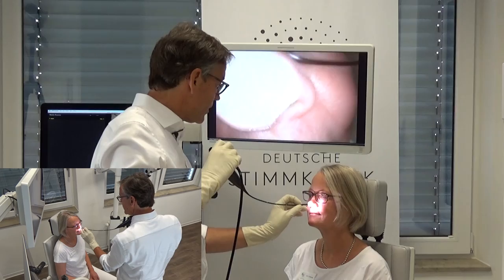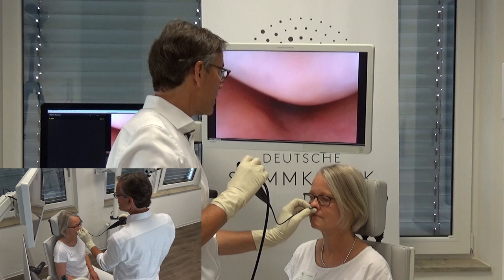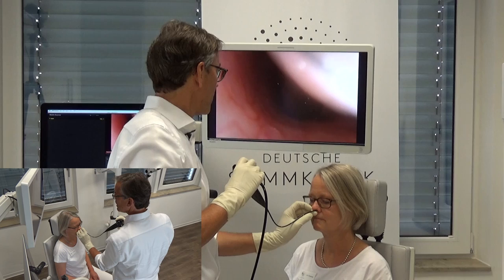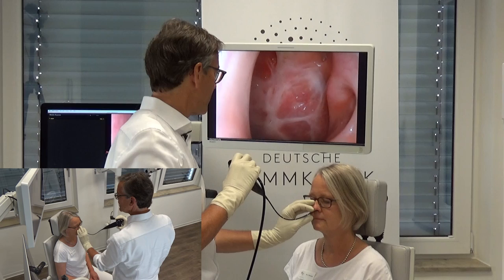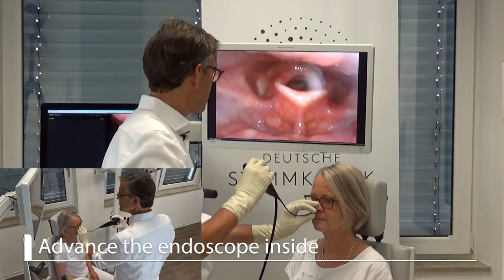Go inside through the nose. Usually the numbing takes place after a couple of seconds so that I can immediately start. She need not help me with her head position — she can just keep her head as it is — and I will control while seeing, and advance the endoscope all the way inside.